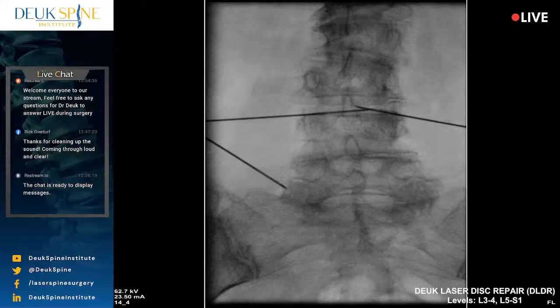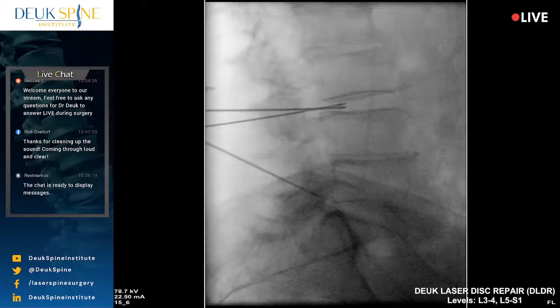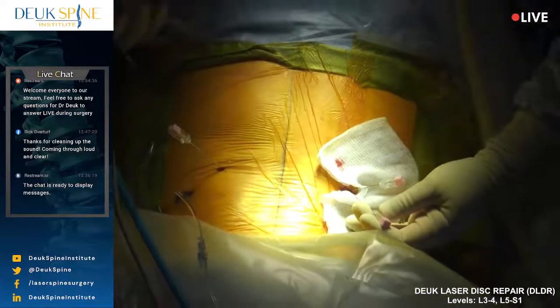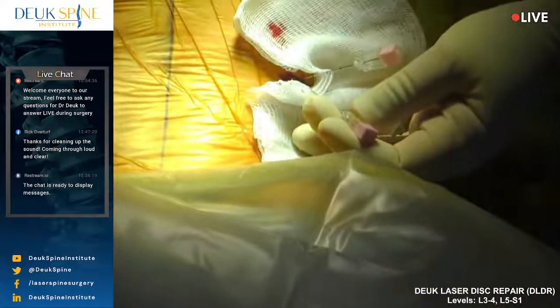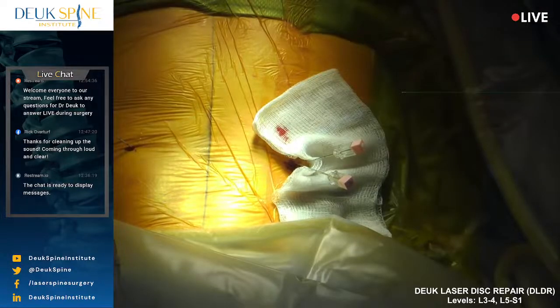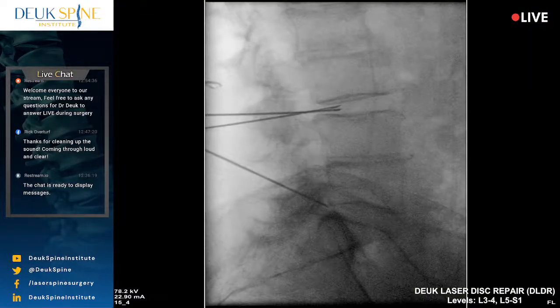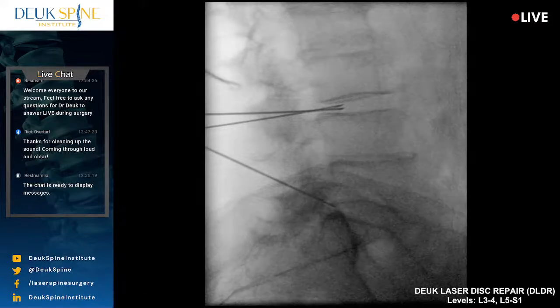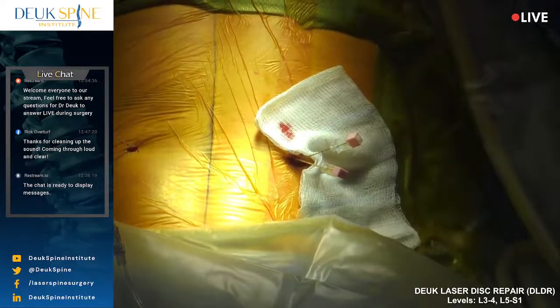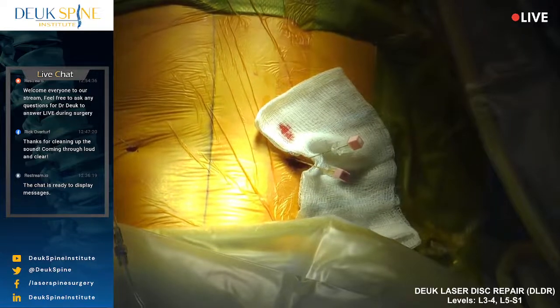So this is always the hardest level to reach, the L5-S1 transforaminal approach. Everything else is much easier. So that's why it's taking us a little longer, but we want to get it just right. Has to be just perfect. So we're going to stay here until we get it just right. Where do you feel it? All right. Back and buttocks are fine. That's perfect. Still back? Where? Okay. Let's give it a minute.